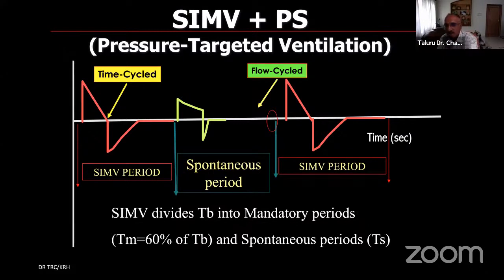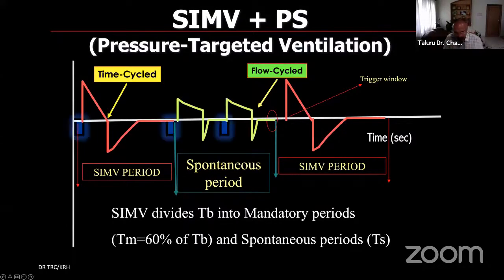On this, you are going to impose a breath like this with a fixed I time and E time. Here there is no fixation of I time and E time. The ventilator manages the I time and E time. Though you may initiate the trigger, sync the trigger, the I time and E time is controlled by the ventilator. Why will the diaphragm contract exactly till the I time and relax during the E time? It doesn't happen that way.